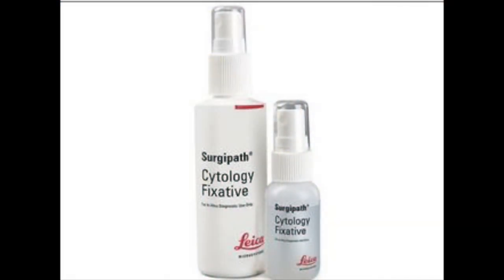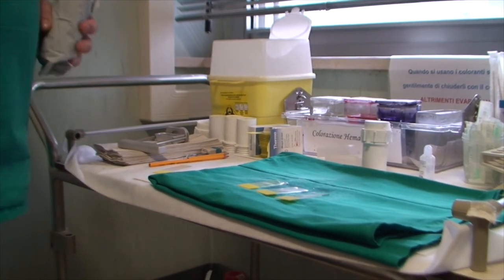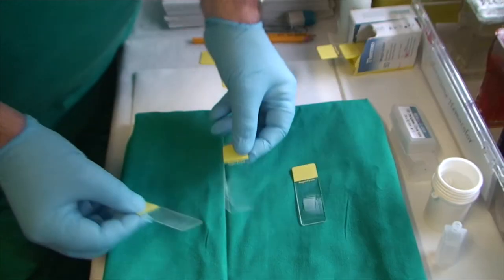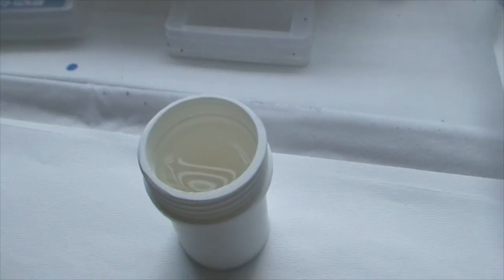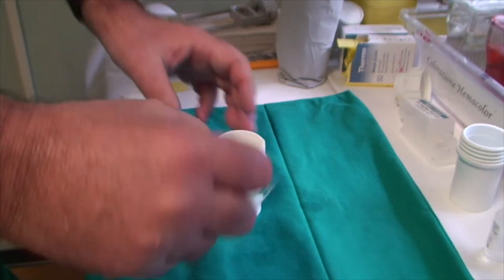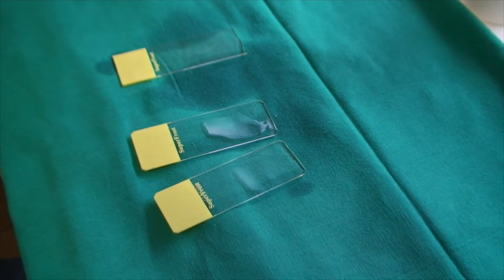The fixative should remain ready upon the table, as fixing must not be delayed. The operator picks up the aerosol fixative and sprays it over the slides for three or four seconds from a minimum distance of 25 centimeters. Within approximately 10 minutes the product dries, and thereafter the sample is ready to be shipped. Whenever the aerosol fixative is not available, alcohol at 95% must be contained in a closed bottle to prevent evaporation. The slide is submerged into the fixative for a few seconds, then withdrawn, dried on its lower side, and laid to dry on the table for five minutes more.